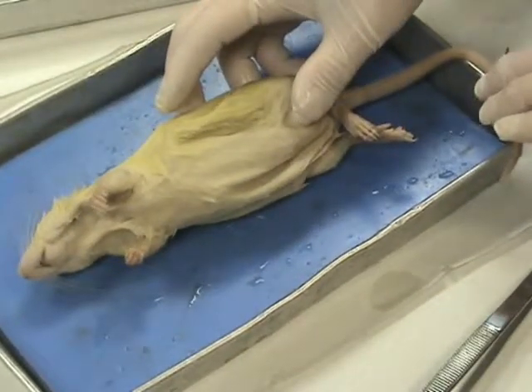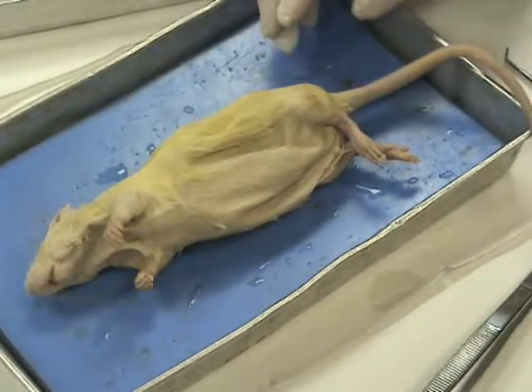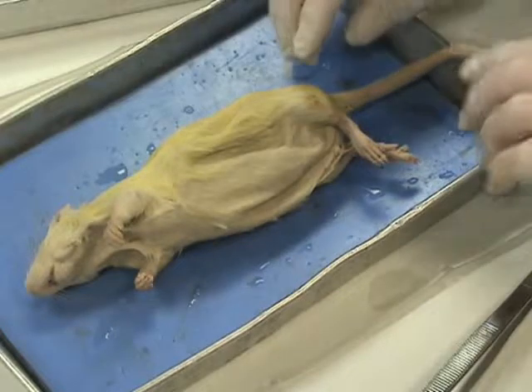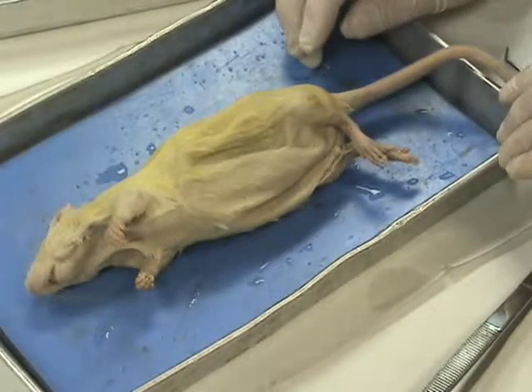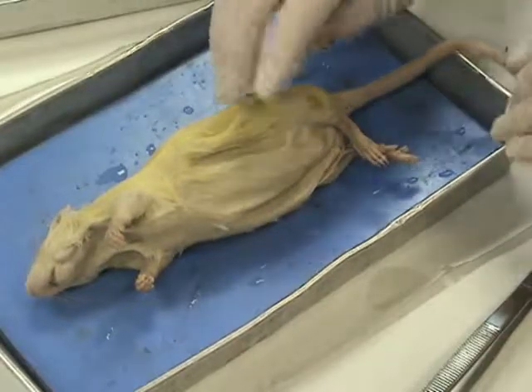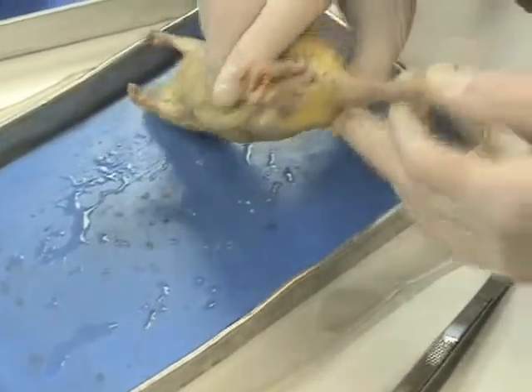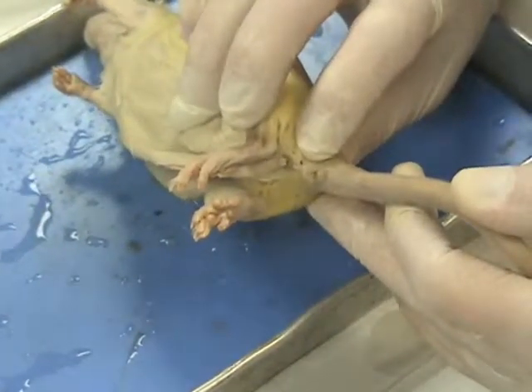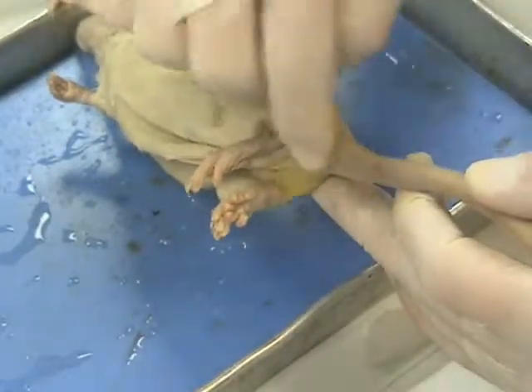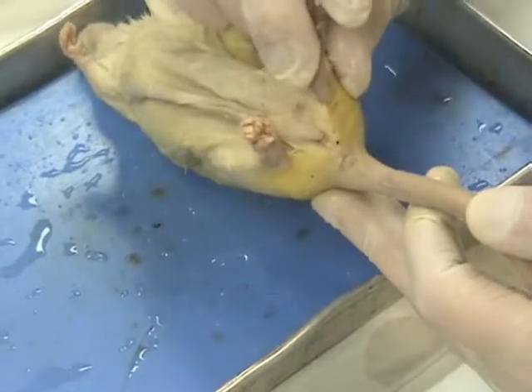Next, we need to figure out what the sex of your rat is. And the directions that you have on that sheet there tells you that the males have the testes, which are located cranial or anterior to the anus. Now, when we're looking for the anus, we're looking up right underneath the tail. In this case right here, we have the anus, and if we're going towards the anterior or cranial end, we're going to be moving towards the head, towards this direction. In this case, I don't see testes, so this is probably not a male.